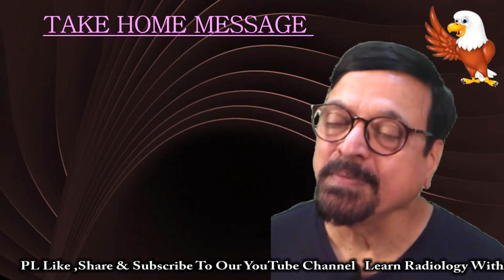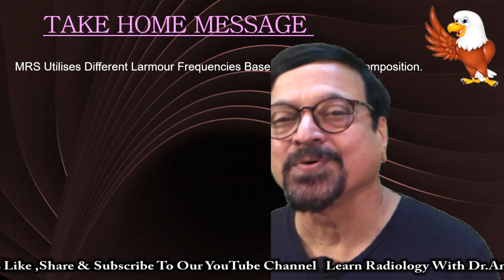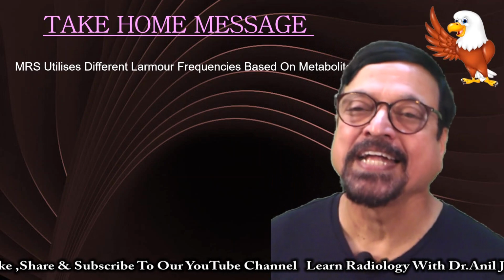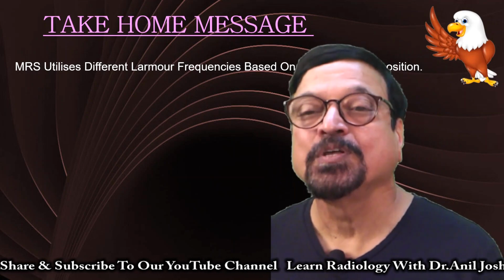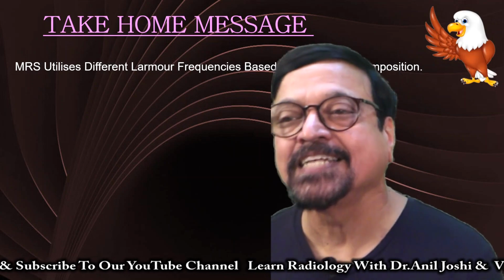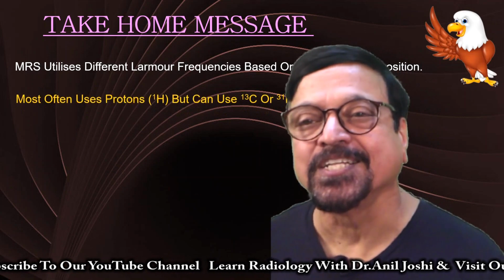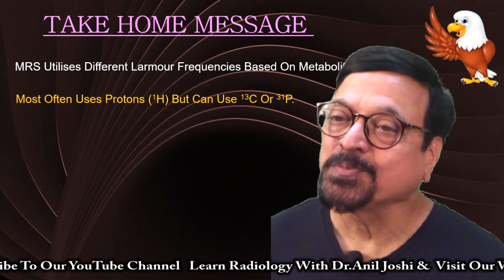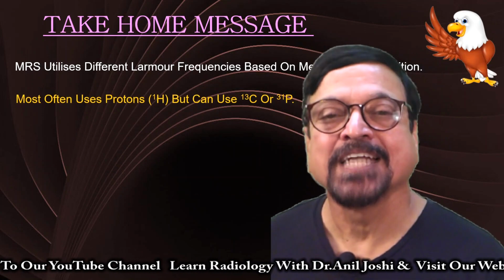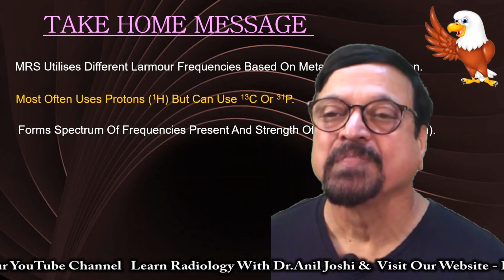Now, what is the take home message? After this short lecture, or long lecture, whatever you call it, after a lot of knowledge you have gained, you have seen how the metabolites can tell us about the pathology. MRS utilizes different Larmor frequencies based on metabolic composition. Most often it uses protons because they are ample in the body, but it can also use carbon and phosphorus.